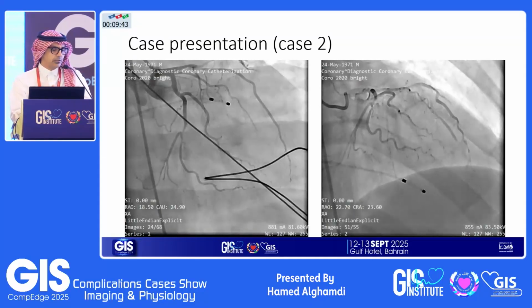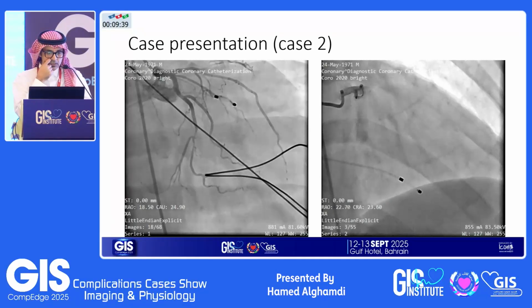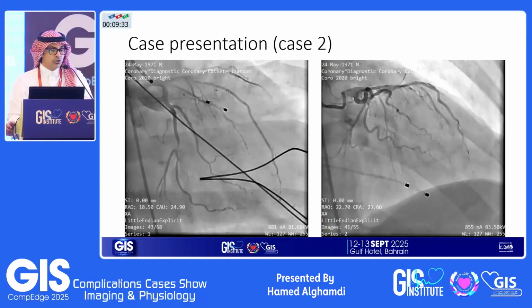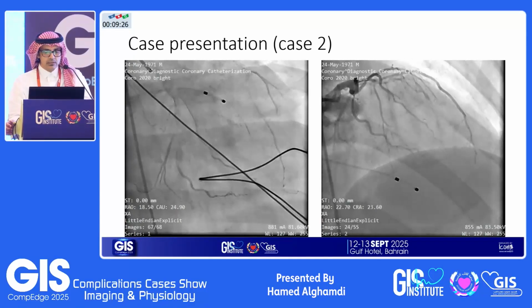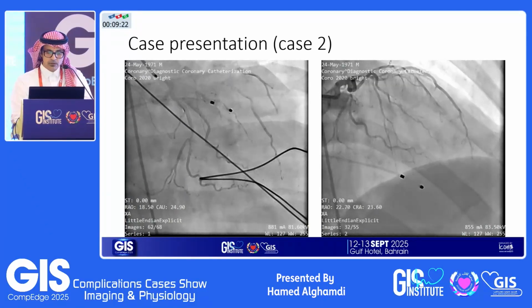We opened it quickly, and during that, the patient had the first VT. We did overdrive pacing because we had a pacemaker. He did okay, and then we switched to the left, knowing that we had a full diagnostic before that. You can see the LAD has TIMI-1 to 2 at best, okay?